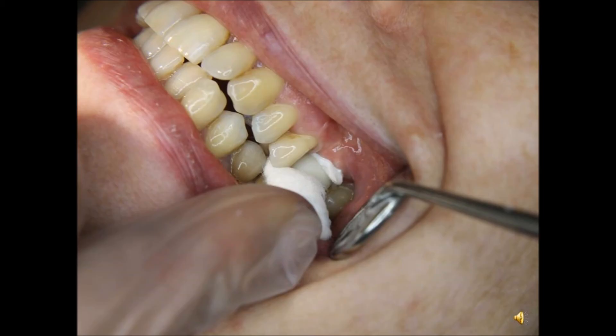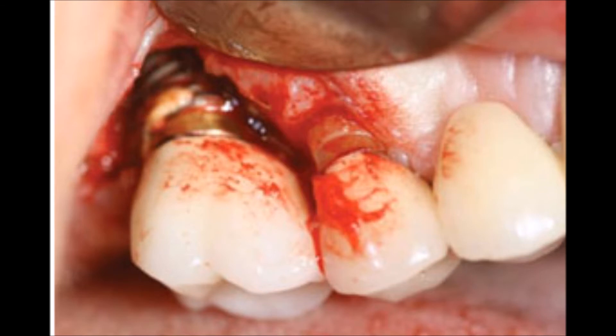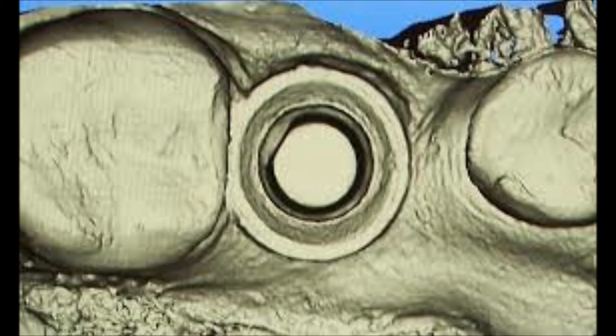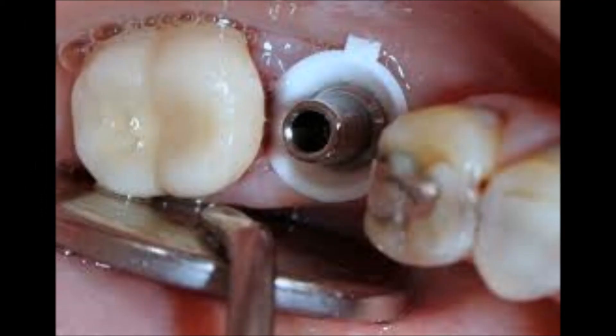Dentists who started using G-Cuff for impressions soon found other uses, such as a cement barrier — preventing cement from going into the peri-implant area. Some practitioners use G-Cuff for solitary transfer impressions in cases where emergence profile contouring is needed. It is also possible to control the expansion of tissue by using one or more cuffs. G-Cuff is the only means for digital scanning of stock abutments without cutting the gingival tissue, saving time and materials on manufacturing custom abutments.